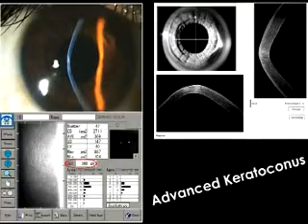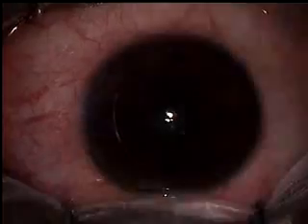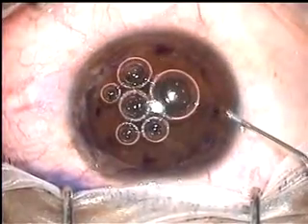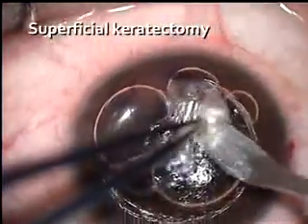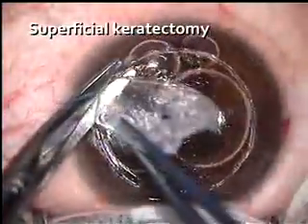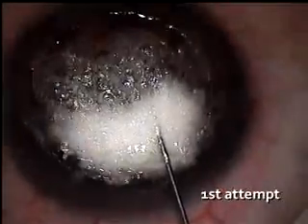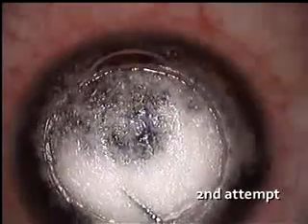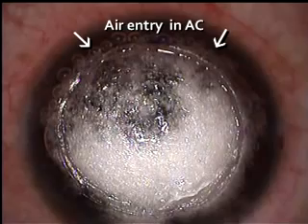Now came that big moment when we tried to implement what we learnt at the wet lab in a real life situation. It was a case of advanced keratoconus. Big bubble DALK was planned. Superficial keratectomy performed. Air injected, big bubble not achieved. Repeated at other site, failed again. Air entered into anterior chamber.